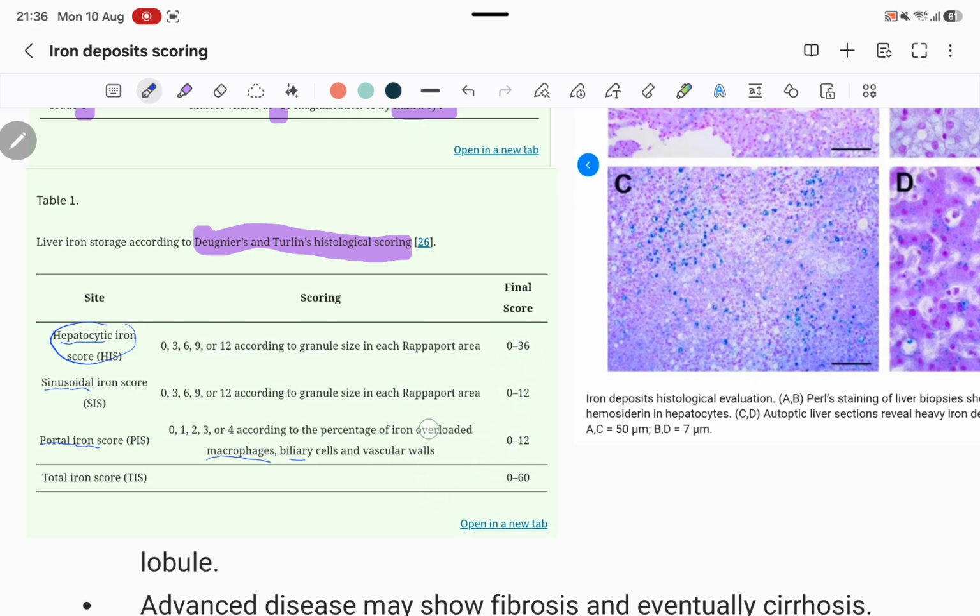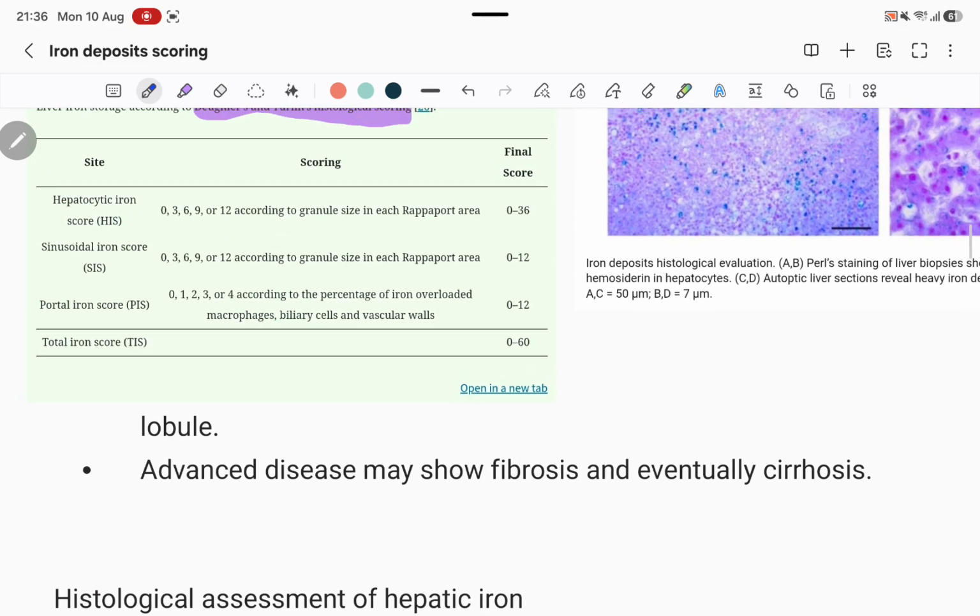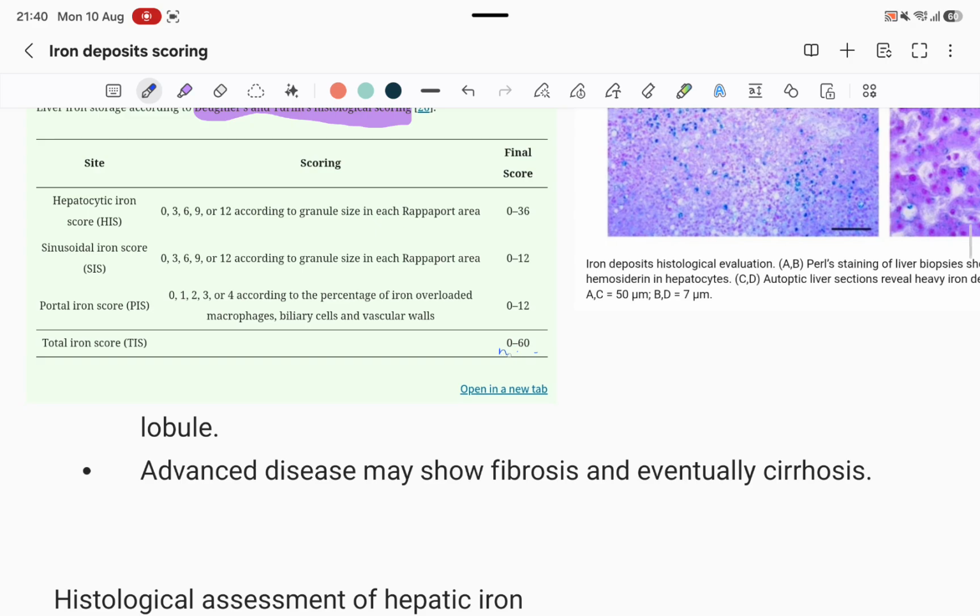And of course, there is that severity. I think that there is much more to this, with scoring of probably mild, moderate, severe. Let's look at it. Okay, so I looked it up and there doesn't seem to be anything to actually associate with the numbers. So if we're talking in specifics, we can say that from 0 to 5 is normal, all right?